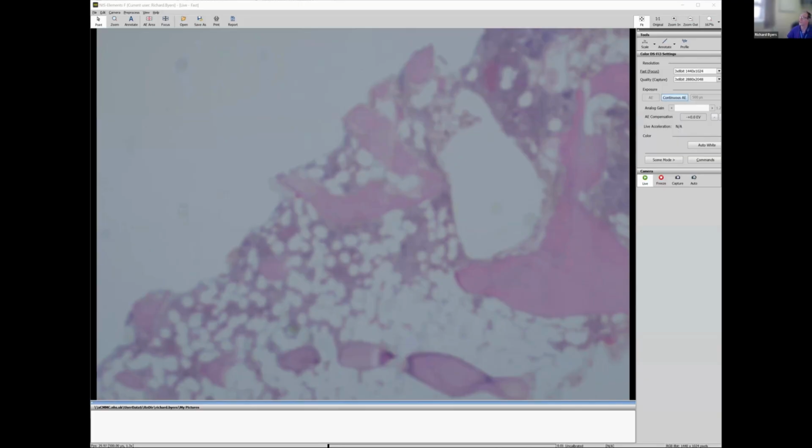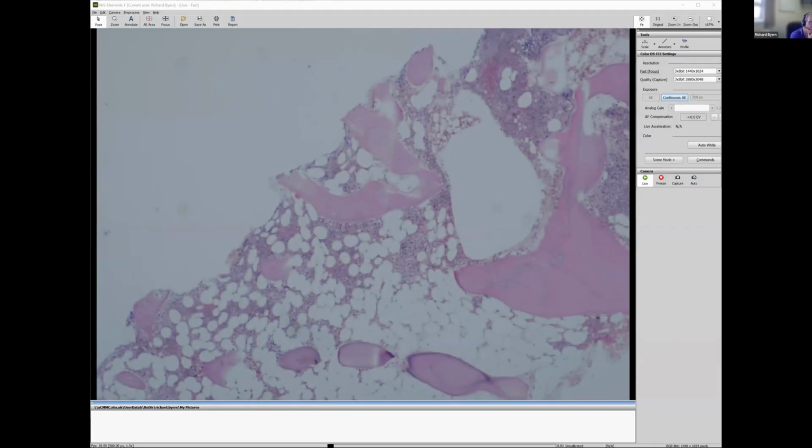The patient has been treated. So this patient had polycythemia vera, which then transformed to secondary myelofibrosis in 2004. There was a JAK2 mutation, and they went on a trial. And this is post-treatment. So this can be a little difficult to interpret, myelofibrosis post-trial.